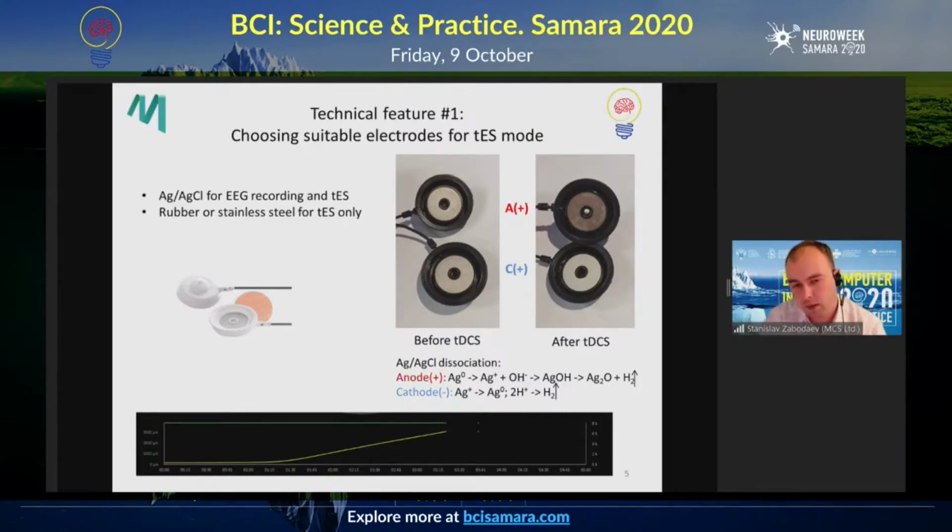The rest, when it comes to the lifetime of an electrode, comes down to the type of current used, the surface area of the electrode, whether it is coated with the chloride silver paint or whether the paint is integrated into it.